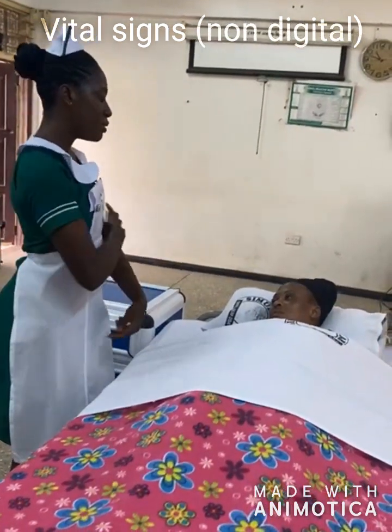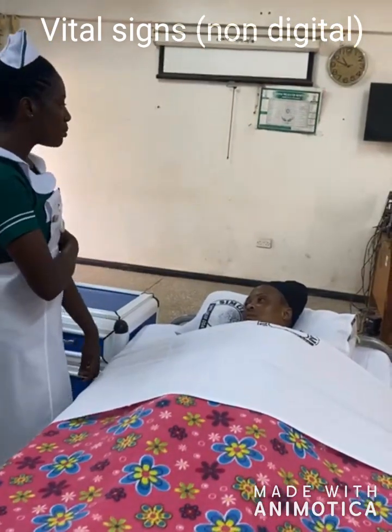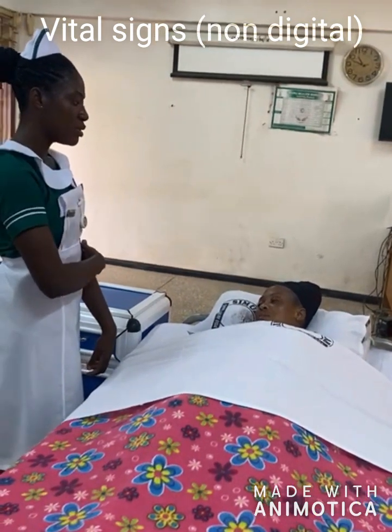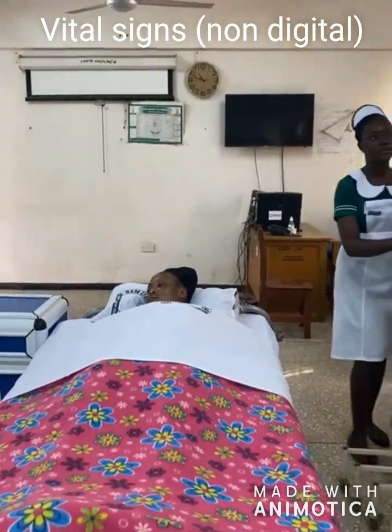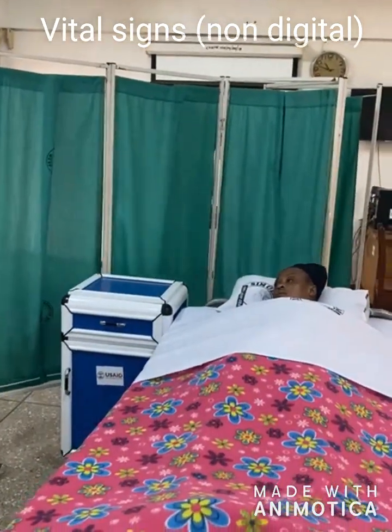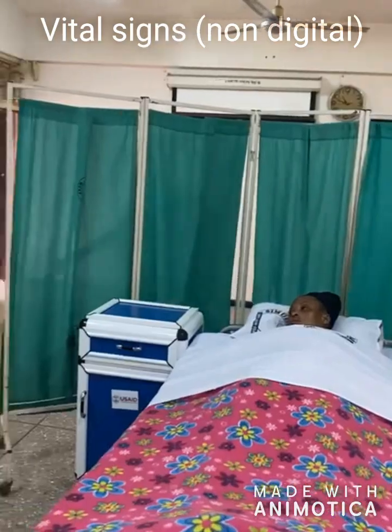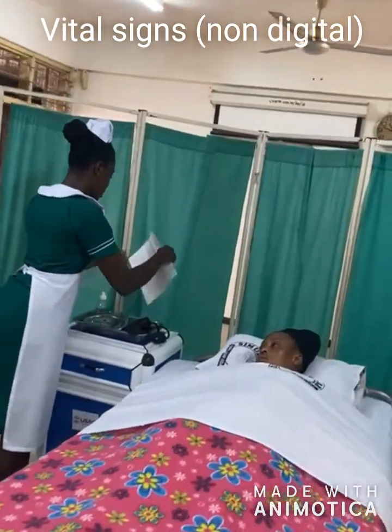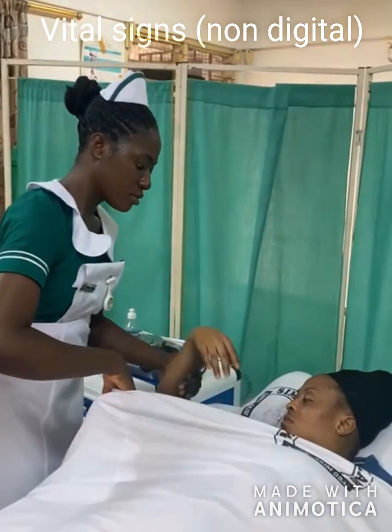When it comes to the blood pressure, I'll use the sphygmomanometer and the cuff will be pressed on your arm a little, but please bear with me. Am I allowed to do this? Thank you.